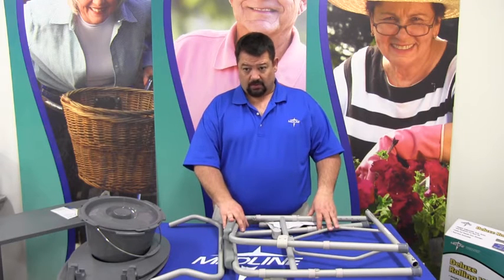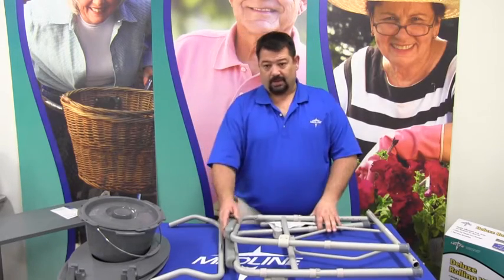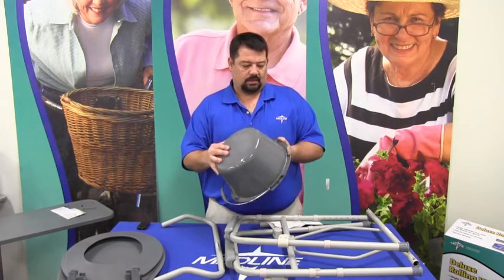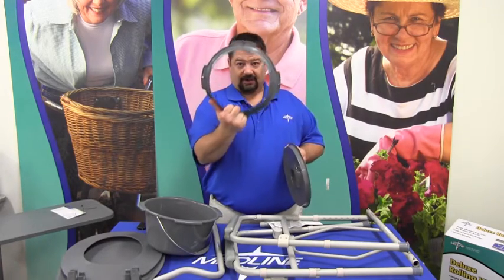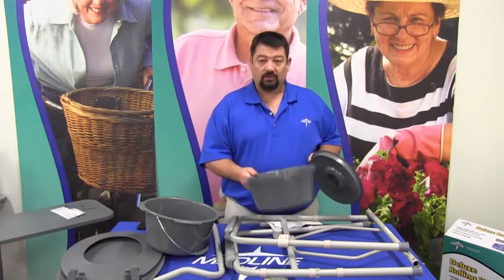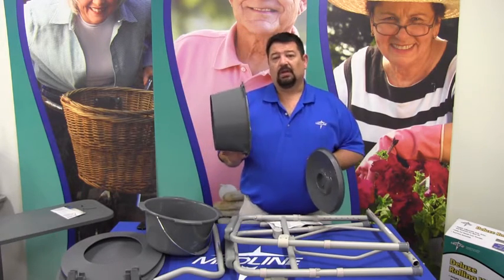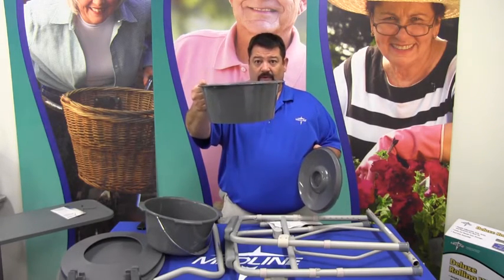This particular version is a folding commode, so when it's not in use it can be stowed away in very convenient areas. It has the frame, the backrest, the seat and lid, the bucket, the lid, and a splash guard. A splash guard is designed only for use when the commode is being used over the toilet — when you're using it as a toilet safety frame or as a raised toilet seat — and it acts as a funnel so that there's no spray. You can raise it or lower it off the toilet, and this will take up the gap to minimize spray.